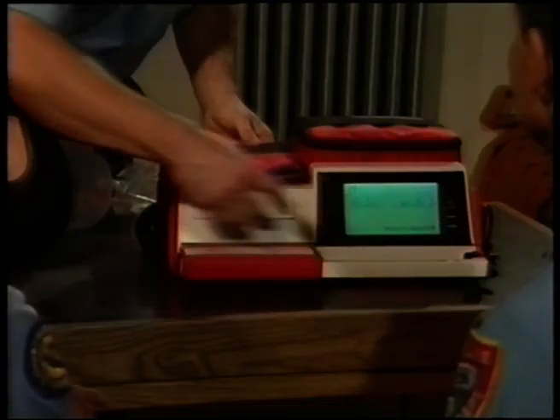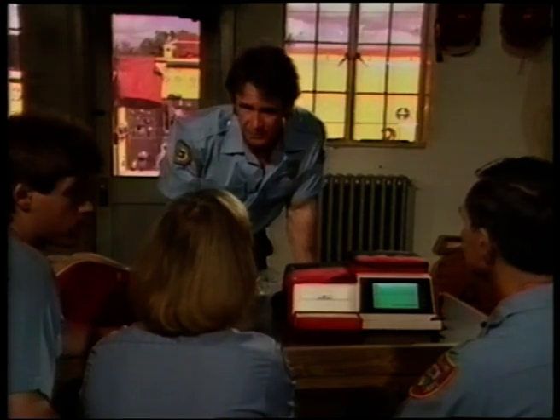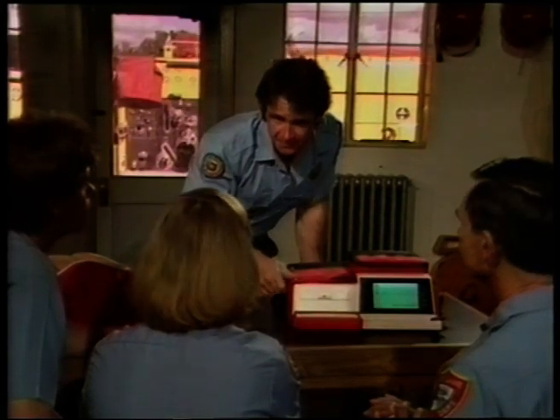Pushing the event button causes an event marker to appear on the C60 cassette tape for later review. Examples of events worth noting are when a pulse is first found or when the advanced life support team arrives on the scene.